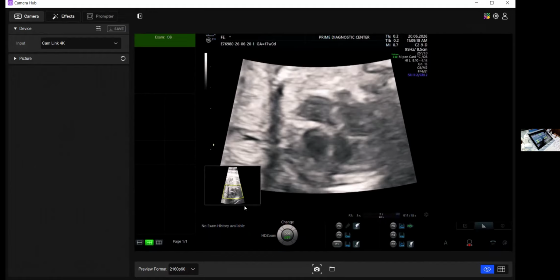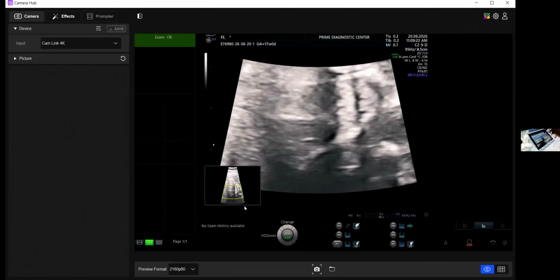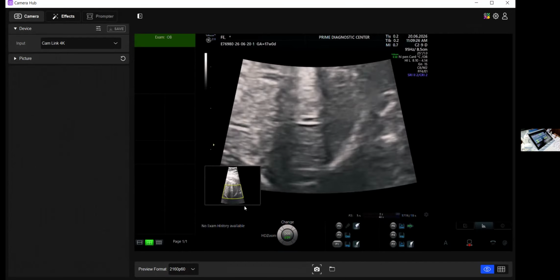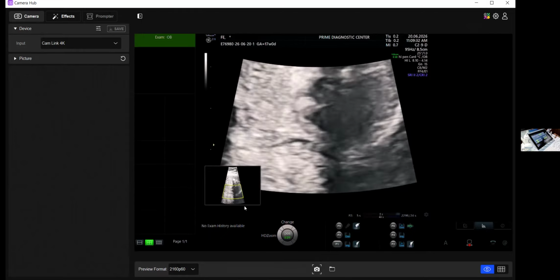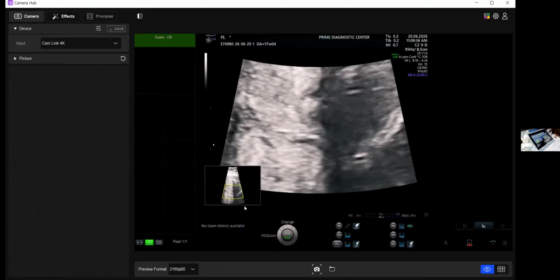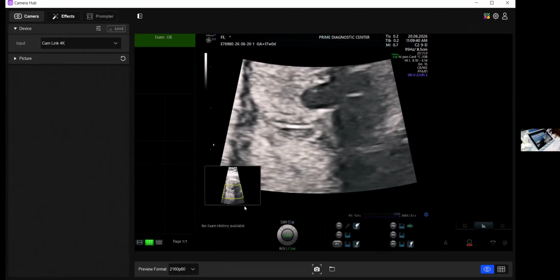No luck in this patient, but maybe we'll try the next. Left atrial appendage is far easier to see because it's conical. It's a kind of an outpouching, but the right atrial appendage kind of merges with the right atrium, seemingly. That's the right atrial appendage. If you can see, this is the right atrium, and that is the right atrial appendage. This one.